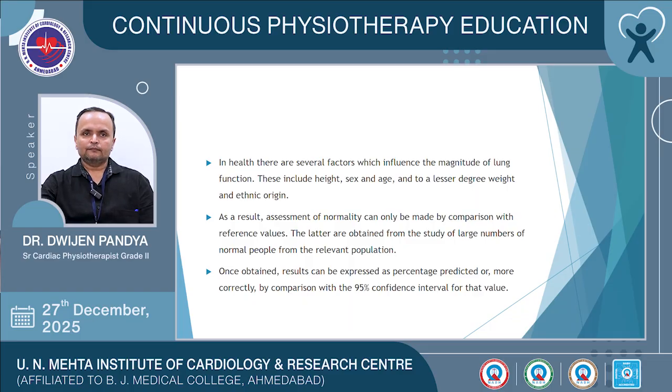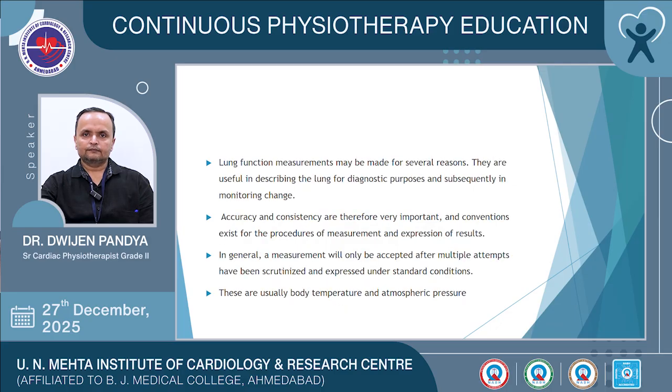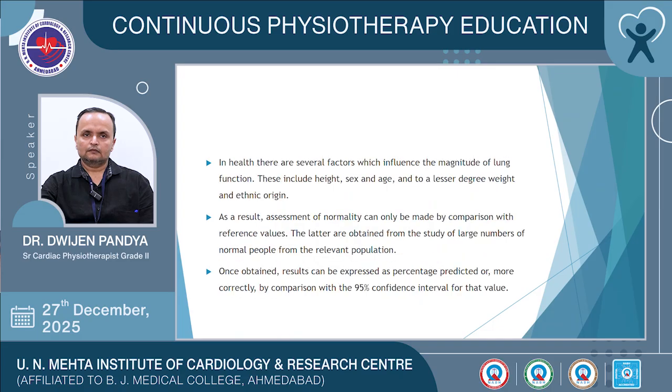Once obtained, the results can be expressed as percentage predicted or more correctly by comparison with the 95% confidence interval for that value.